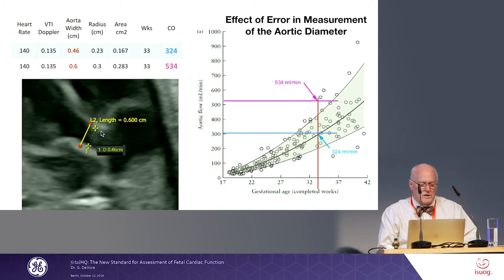Here it is right here. This is the appropriate measurement. This is the corresponding computed flow, okay? And look where it falls. It falls right here in the normal distribution.